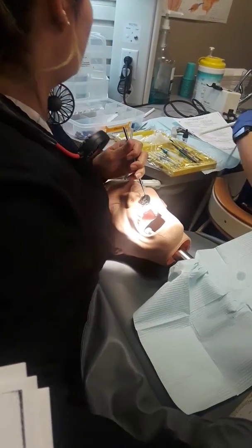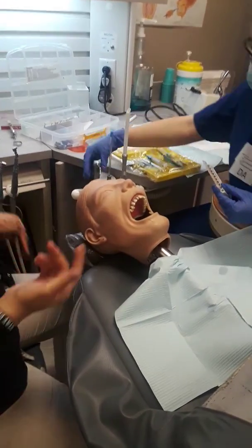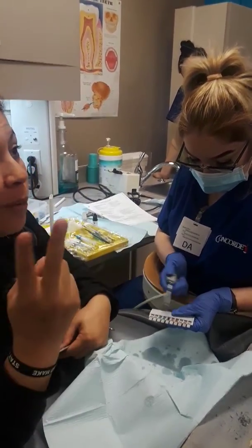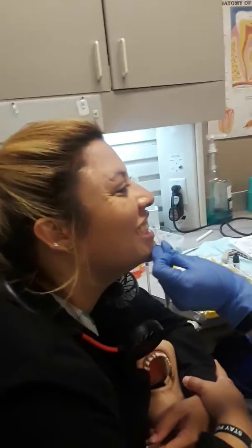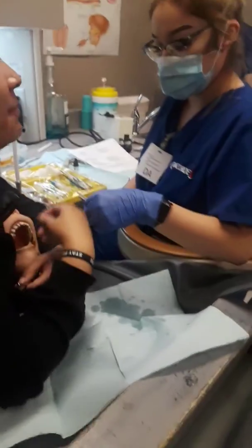We're going to turn off the light because it has a yellow hue. She's going to pick the shade — there's a specific way I like my shade taken. My teeth need to be wet because dry and wet teeth are two different shades. We're going to make them wet and shade match, then look at the blue bib periodically.